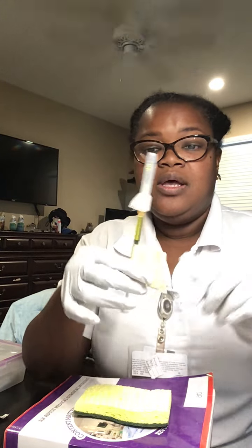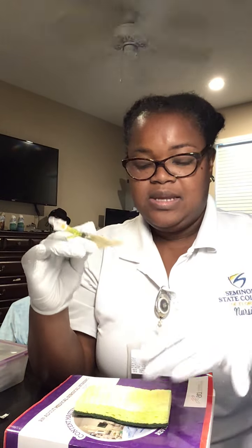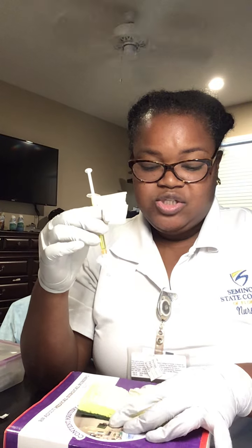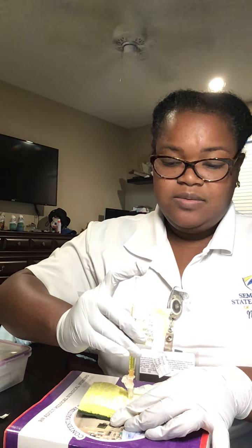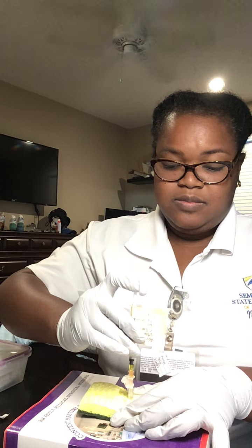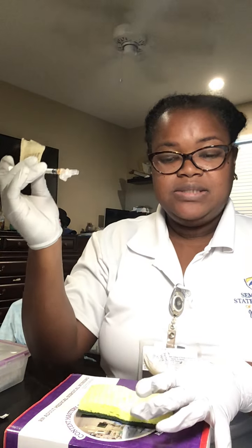I'm going to do the subcutaneous vitamin B12 injection. Okay, I'm going to open the needle with my non-dominant hand. I'm going to pinch, insert at 90 degrees, slowly, take it off and release.